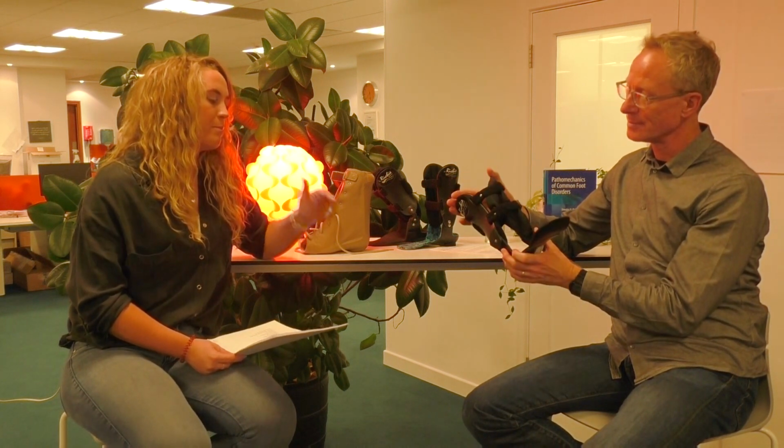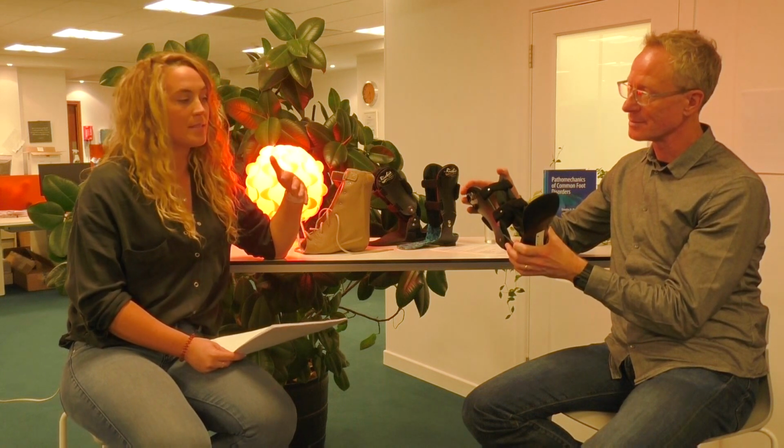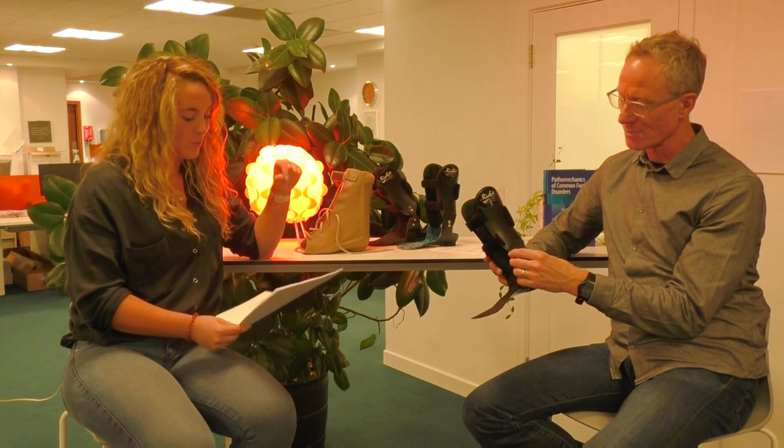Yeah, and many AFOs that we would see in our clinic that are wanting our help or us being involved, would come in classically with a flat foot plate. So it's really that custom made part that makes the Richie brace so much better. Yeah, so most AFOs are the back slab, and then a flat foot plate. Yeah, absolutely. And then you touched on how you're dealing with all 3 planes, and I think we use the word joint coupling, so people are asking us, what is joint coupling?